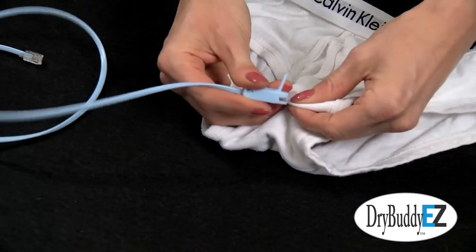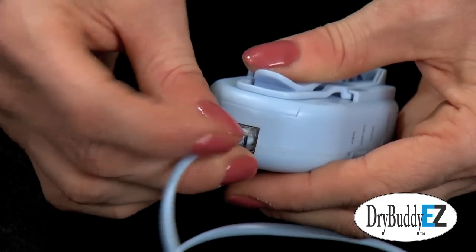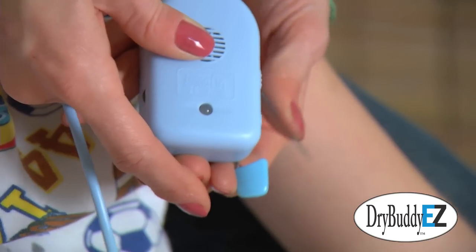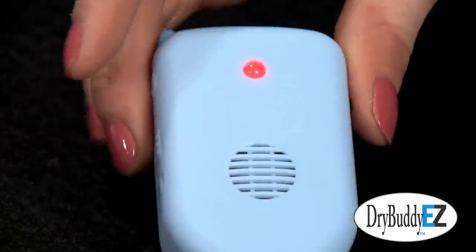Simply clip the sensor to standard cotton briefs near the point of urination, then securely plug its cable into the alarm box. The alarm conveniently attaches to the nightshirt with its clip or a safety pin. When the briefs become wet at the sensor clip, the alarm turns on, waking your child.